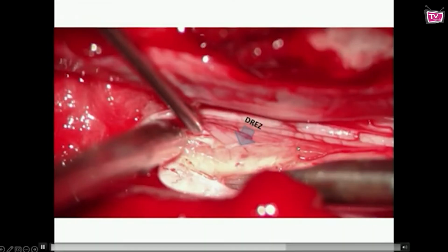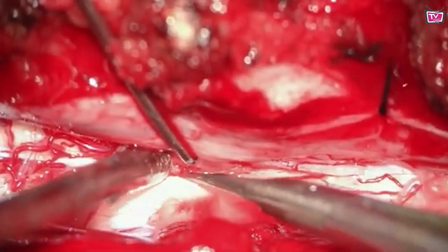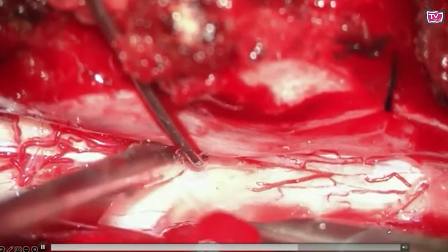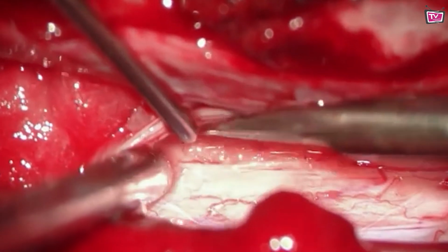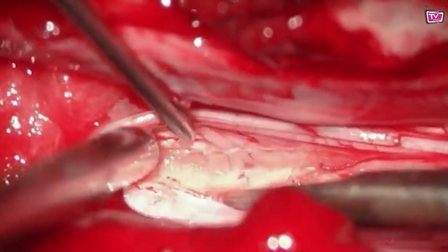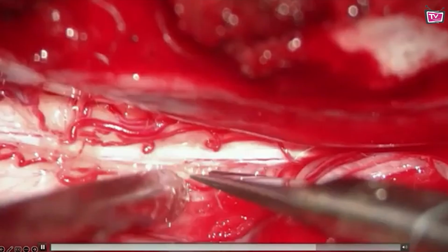And you start by going from one root, a couple of roots above, normal roots, because when the pain fibers go across to the opposite side in the spinothalamic tract, they go up 2 levels and then go. So that is the reason you go 1 to 2 levels above the normal level. You can see the descending vessels there.